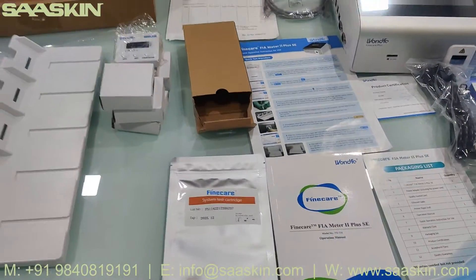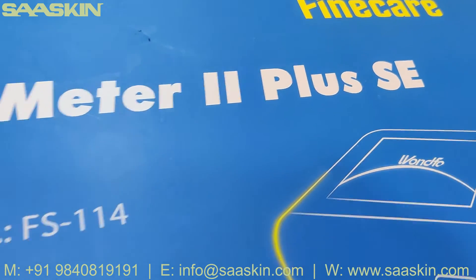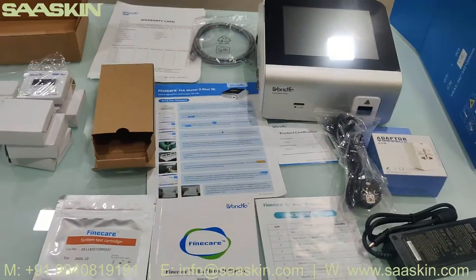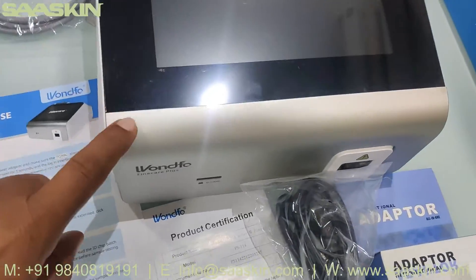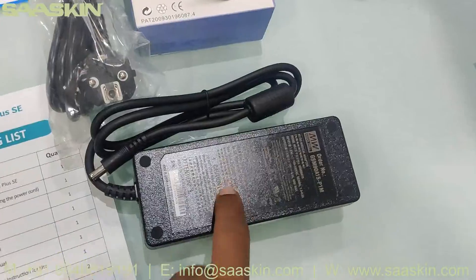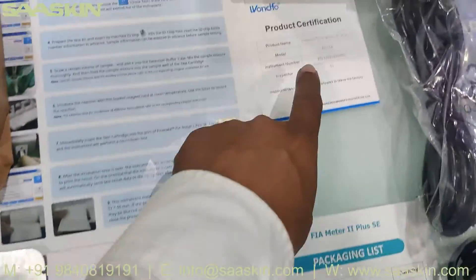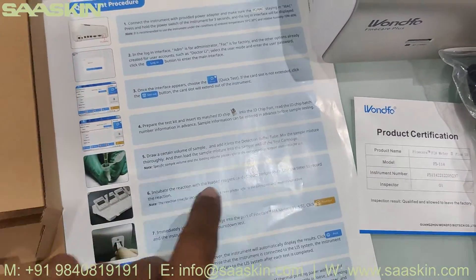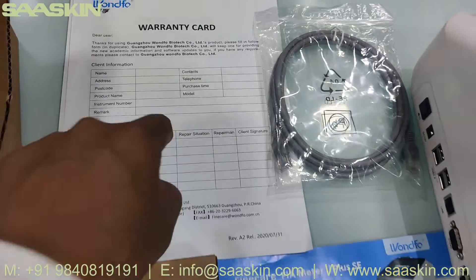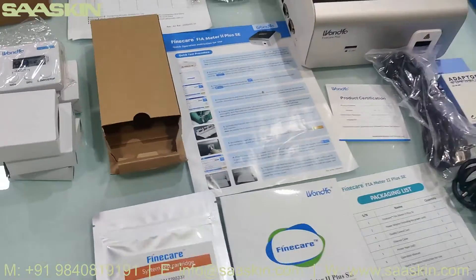To summarize, today we've seen the unboxing of FineCare FIA Meter 2 Plus SE, model number FS114. In this total order you get one main FineCare machine, one power adapter, one power cord, one packing list, one operation manual, product certification kit, one quick reference test procedure details, one system test cartridges, data cable, warranty card, and one additional operation platform with timers.